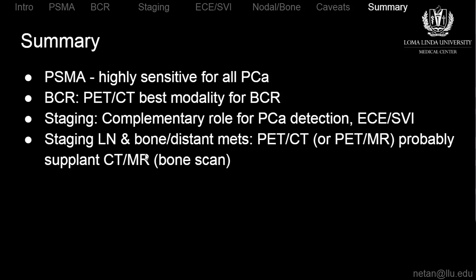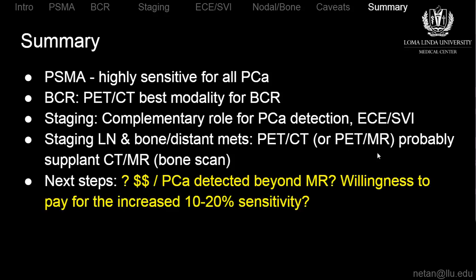For staging lymph node and bone as well as distant metastases, PSMA PET-CT is very effective, and there's insufficient evidence at this point, at least, for the added value of MR for PET MR. And my suspicion is that PSMA PET-CT will supplant current imaging to evaluate for lymph node as well as distant mets.